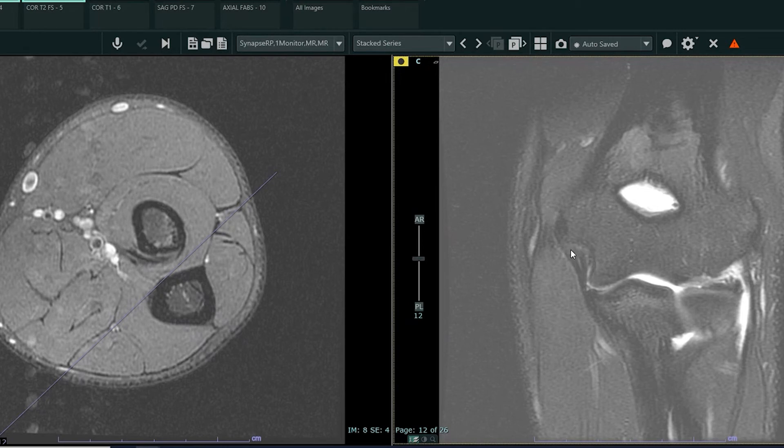The ligament, for the most part, looks intact — maybe a little bit of fraying — but for the most part, the ligament is intact. So no injury here.